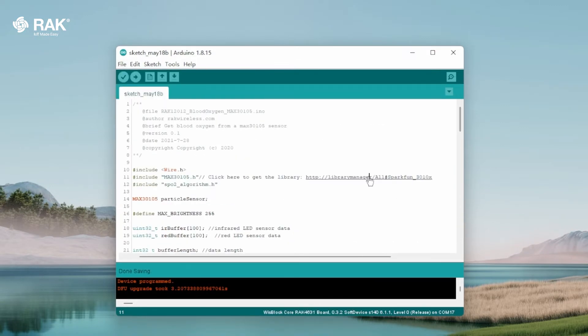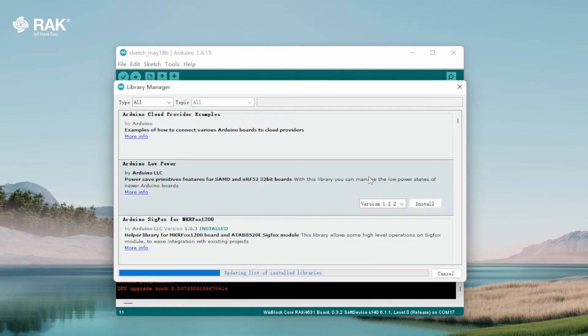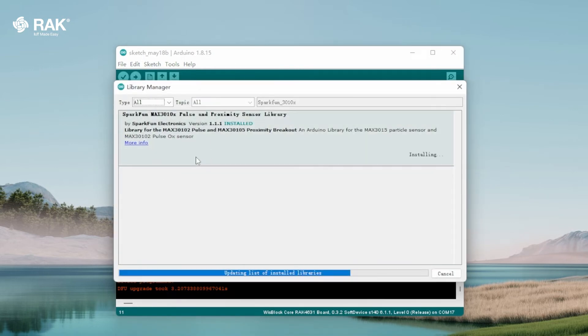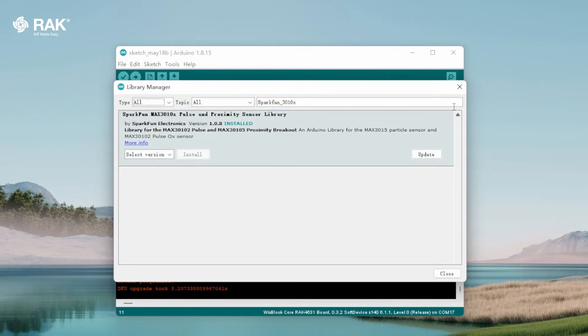Go to library manager and install sparkfun max3010x pulse and proximity sensor library.